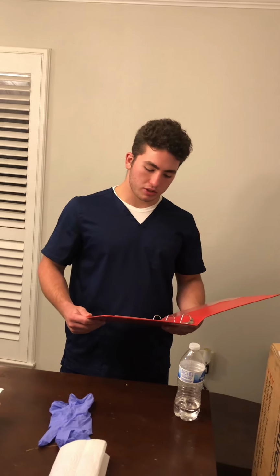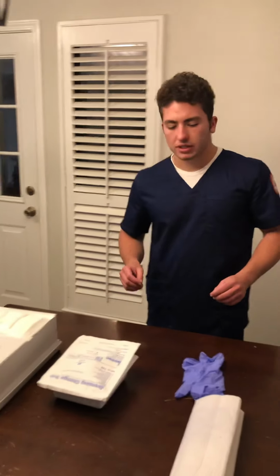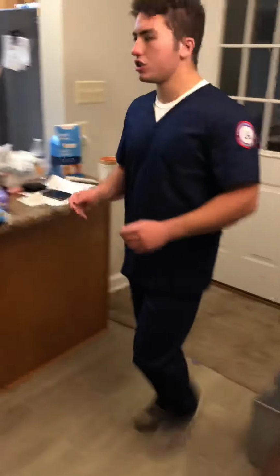My name is Tristan. Today I am a student with the University of South Alabama Nursing Program. I'm going to be doing a wet to dry dressing change procedure for you today. I'm going to verify the order and the hospital's policy on the procedure. Everything looks good. I'm going to ensure all of my equipment is in place and ready to go. Everything seems good. Now I'm going to perform hand hygiene.